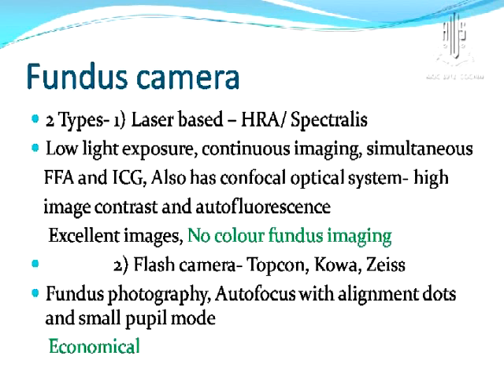Coming to the flash camera, there are various manufacturers like Topcon, Kowa, Zeiss. It enables you to do fundus photography, which forms an essential part of any presentation. It has an autofocus facility now with alignment dots, which enables you to take photographs without a problem, with not much evaluation needed, and enables you to work in small pupil mode. These are the newer technologies that have come in for all these cameras, enabling you to take pretty good images, and they are fairly economical.